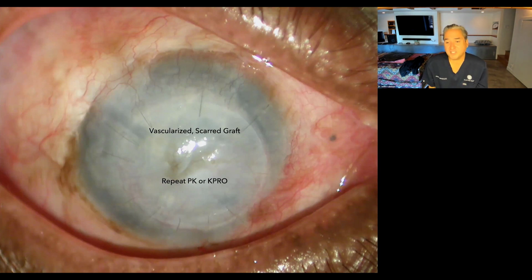You also want to make sure, in this patient, did they have good limbal stem cells? It doesn't look like it, right? You could do impression cytology and see if there's any goblet cells. Is there any corneal epithelium there, or is it all conjunctival epithelium? If that's the case, you're going to have to do a stem cell transplant from the other eye and let it heal up before doing a PK. Another option, if you don't have the other eye to do anything on, a K-Pro may be the best option in this patient.